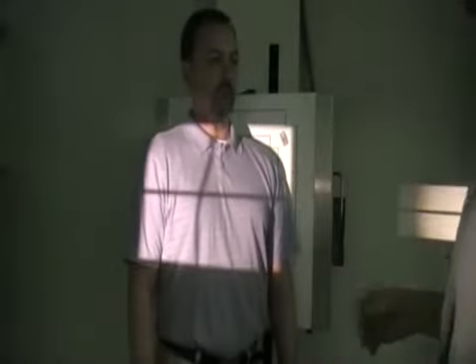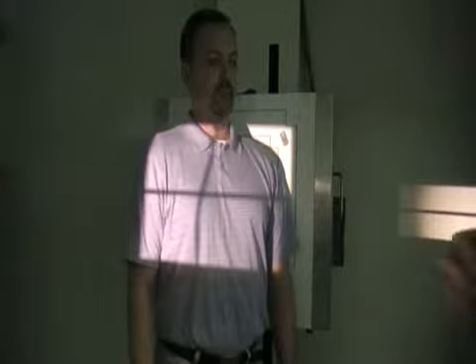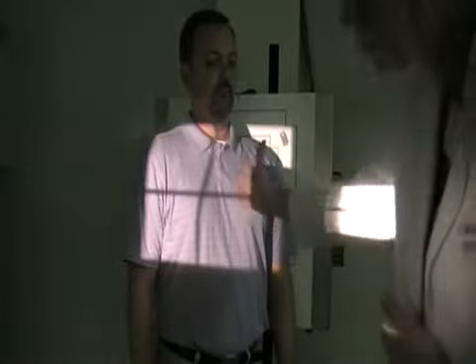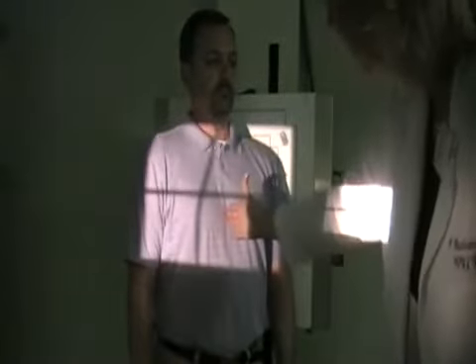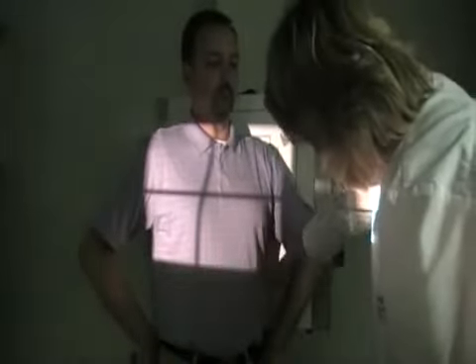And what you want to check regarding chest x-ray obliques is that you want the light field to include both of the lungs. So look at the patient. Here's the midpoint. Central ray is going to be cutting through the upside. I'm going to put his hands on his hips just so that you can see the light field.